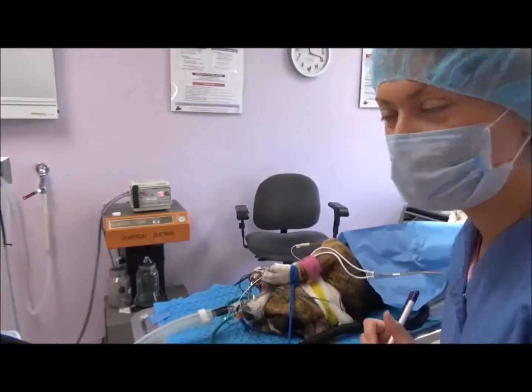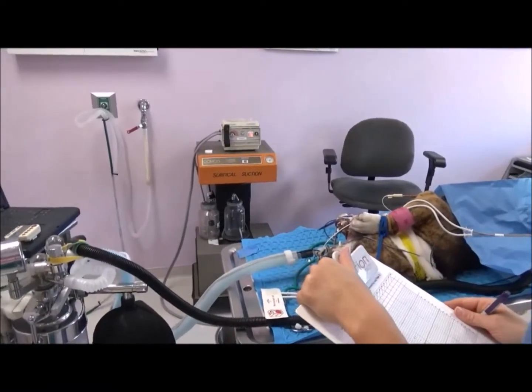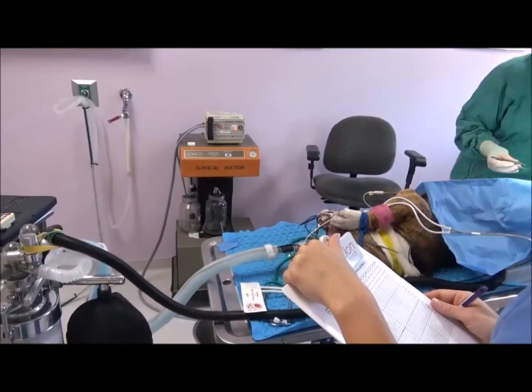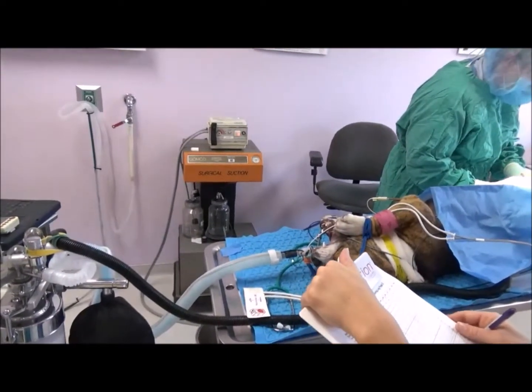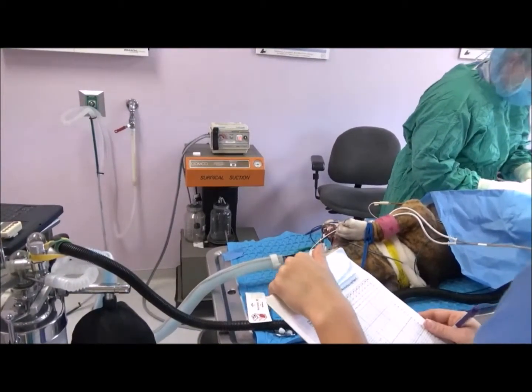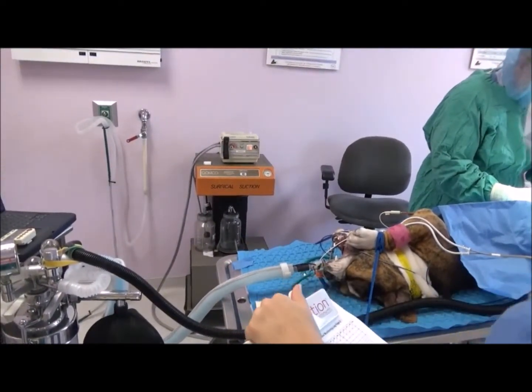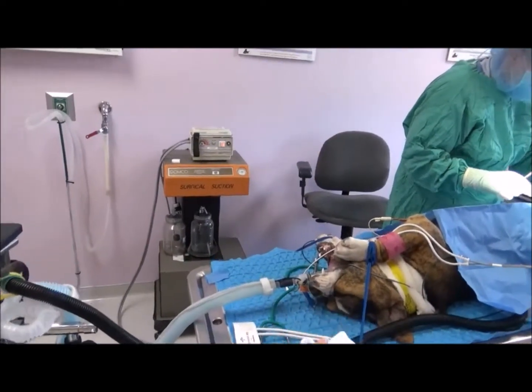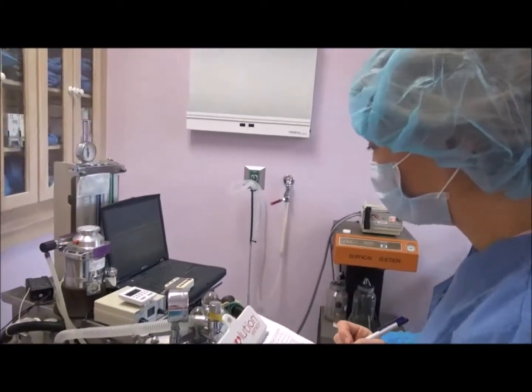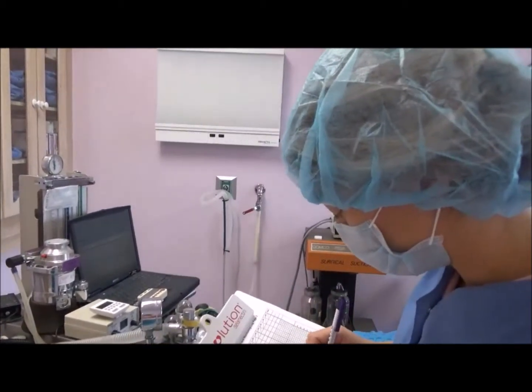This is our canine neuter patient today. Bit past the 5-minute mark just with having to inflate the cuff, so I won't note it exactly on the line.